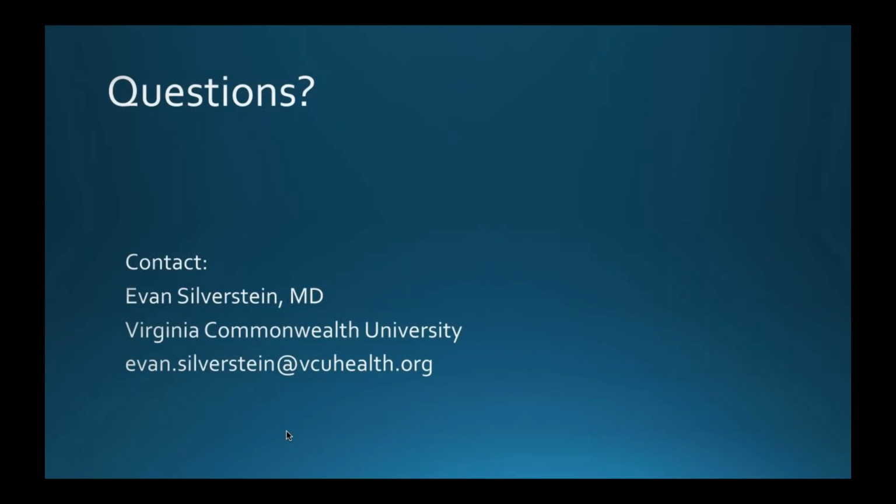The conclusion here is that if you do photo screening only in third grade children, you pick up more children who have a potential issue, and more of those children that you refer need glasses. With the caveat that you have to look at the child as well and try to understand if they're having any issues from the teachers' or the parents' perspective.